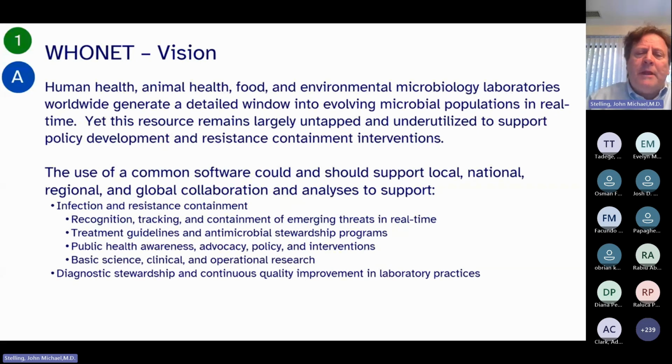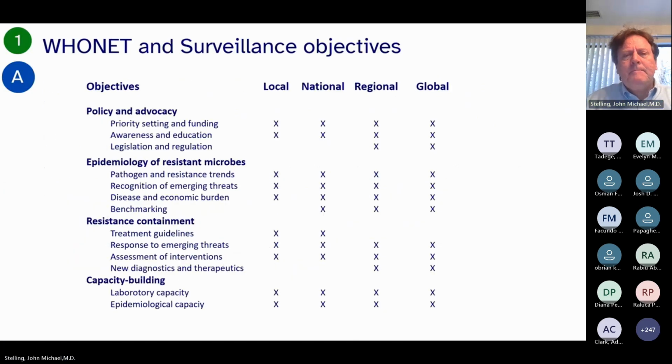I'll come back to this point later, but for all of the analyses we will discuss, I always view it from 2 perspectives. Yes, of course, epidemiology: what are the data telling us about resistance and microbes, obviously. In addition, in every analysis, there is some quality element. Do these results make sense? Are they testing the correct drugs, or are they testing invalid drugs? Does there seem to be evidence of contamination? So for every analysis we look at, first I will approach it from the perspective of quality assessment, and secondly, from the perspective of resistance interpretation.